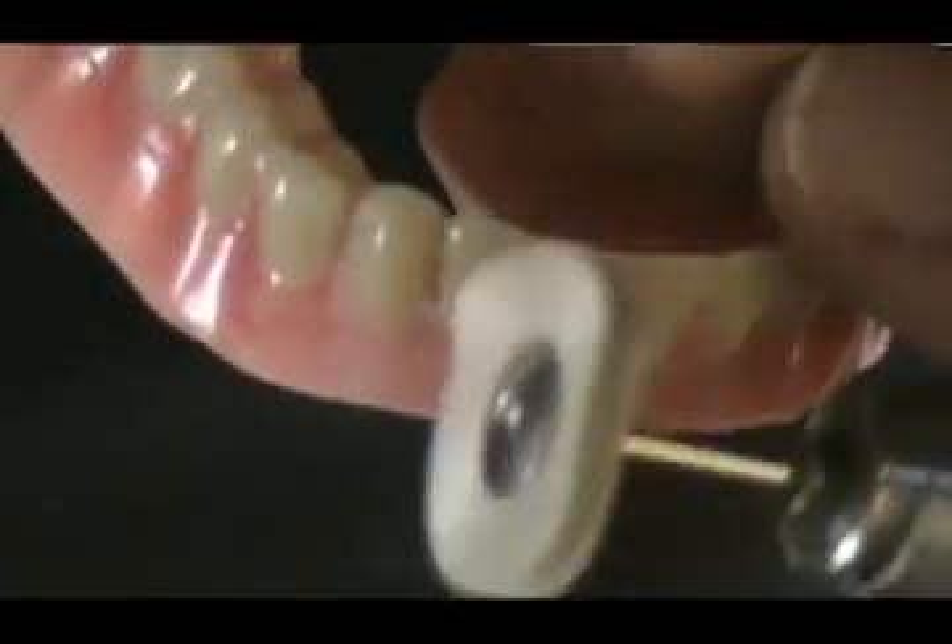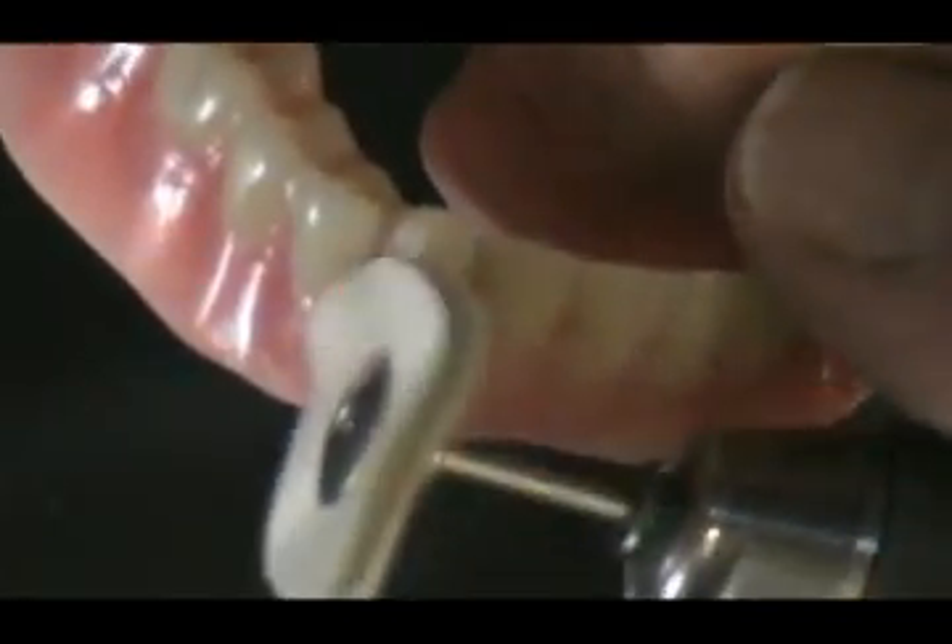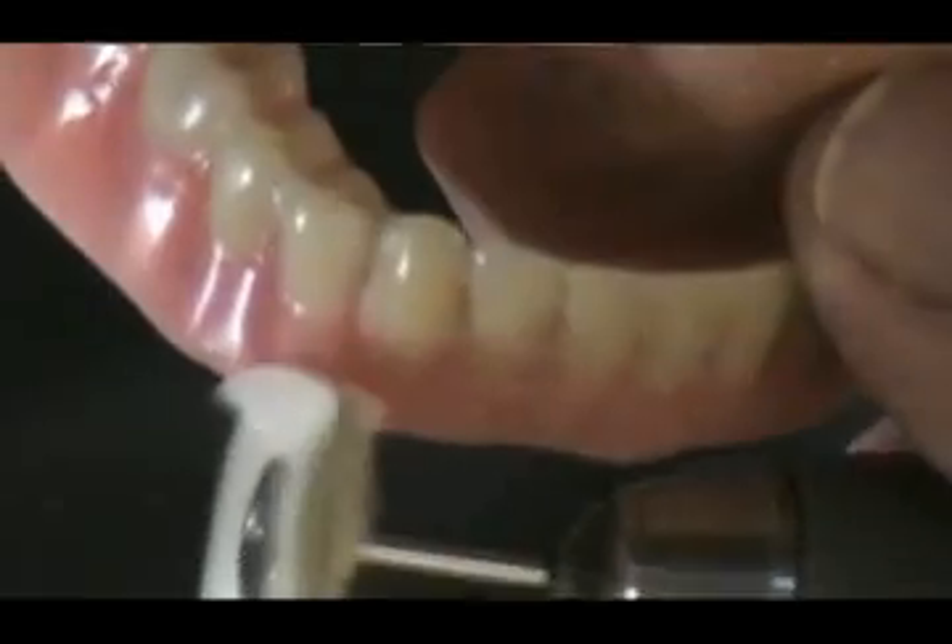The materials are easy to adjust and polish as they become integral with the acrylic resin and leave a smooth, non-irritating aesthetic surface.